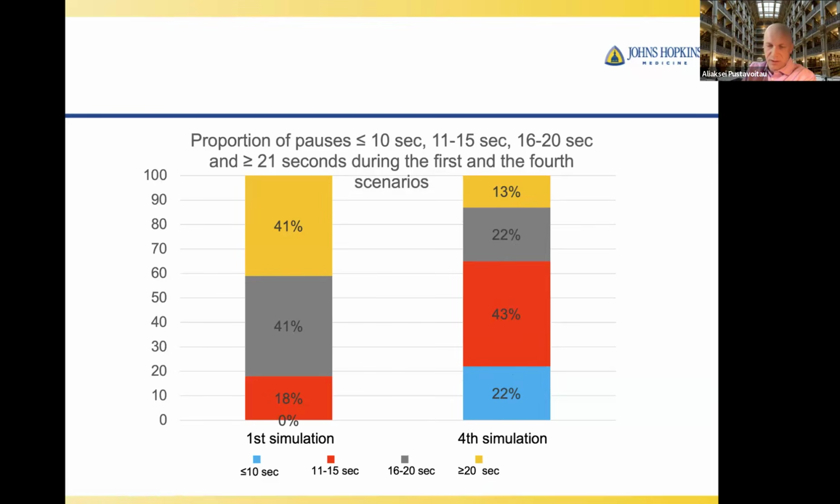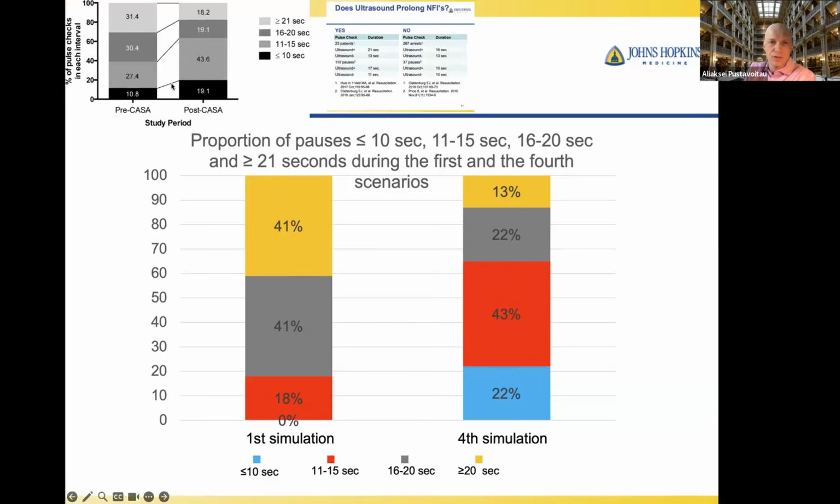Substantial improvement, not perfect. The funny part, if you see this small graph, remember some of the studies I mentioned that said, yes, ultrasound extends pauses, no, ultrasound doesn't extend them. This is from the study that showed that ultrasound does not extend pauses, but it showed before and after training. And when you look at the after-training results, they're almost identical to the ones that we showed. So between both of those studies, it shows that training really matters. Training, simulation, and possibly repeat simulation really matters.